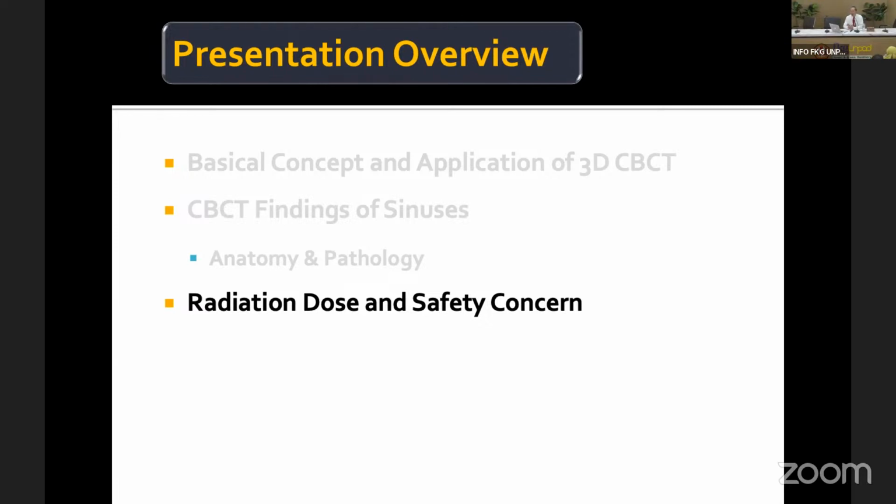But some practitioners in the United States, in the early days, when they got the machine, said for every endo patient, I'm just doing the CBCT now. Every orthodontic patient, I'm just doing the CBCT. For implants, it was the same thing. For the pre-surgical assessment, use the CBCT. Right after the implant, do another CBCT, and then at 3 months and 6 months, they follow up with CBCT, because they have the CBCT machine in the dental office.